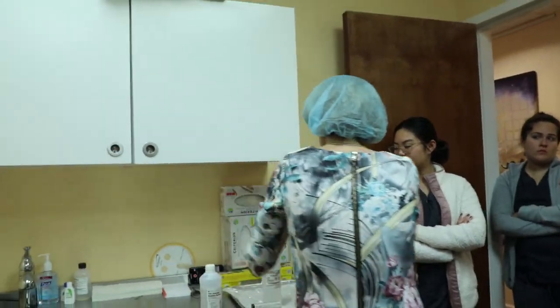Let me re-demonstrate that with the glove on, just so that for the camera it's very obvious.